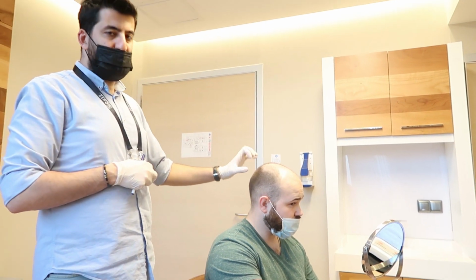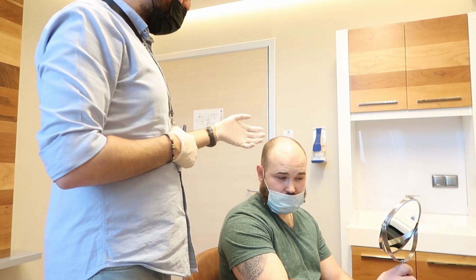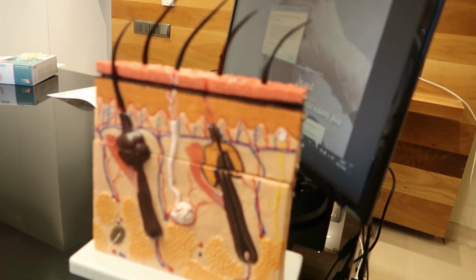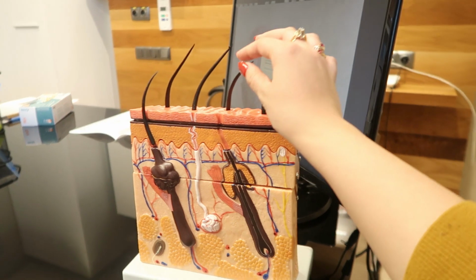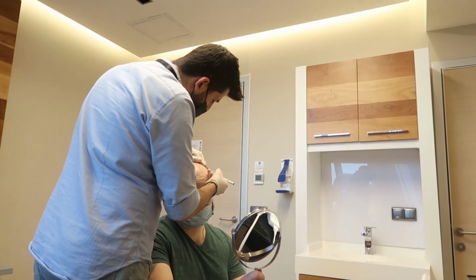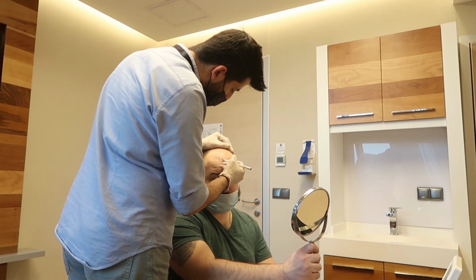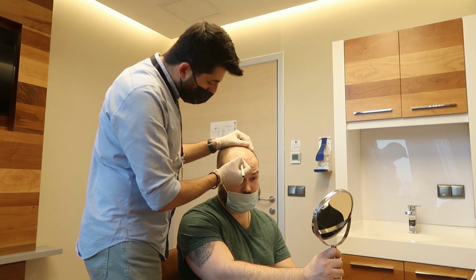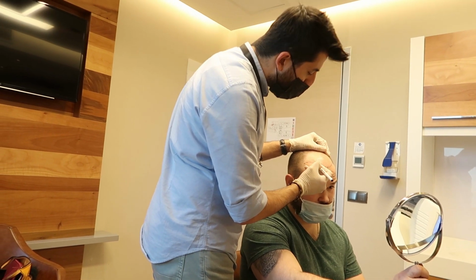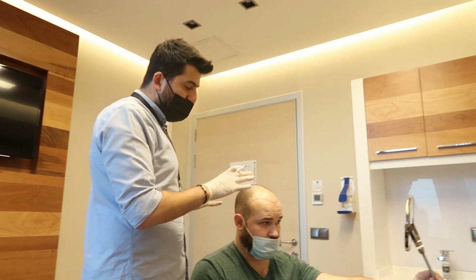The size of the donor area is a little bit small compared with a normal strong donor area. That's why the number of grafts that we can harvest will be a little bit limited. Could you raise your eyebrows up, sir, as much as you can? When you raise your eyebrows, we can see your forehead muscle, the occipitofrontalis muscle, and that muscle is generally our border. There are lots of factors that we have to be careful about when drawing a hairline, but one of the most important factors is that muscle. Your muscle border is almost like that.